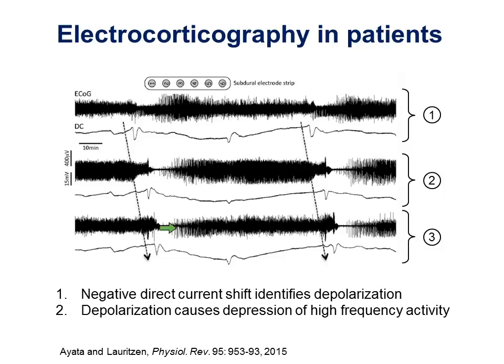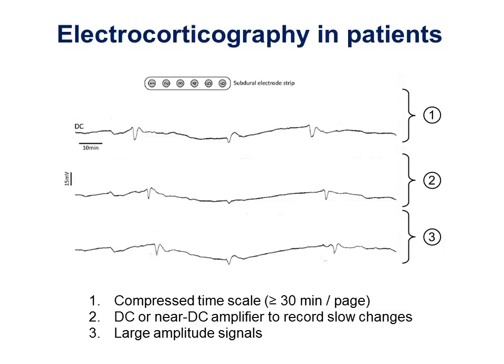So let me now further explain how to obtain these recordings and how these differ from conventional EEG, because there are pretty considerable differences. And I think many people come to this field with a background in clinical EEG. So in the raw data acquisition, we get recordings similar to what are shown here. Now, again, this is the same trace as shown in the previous slide.